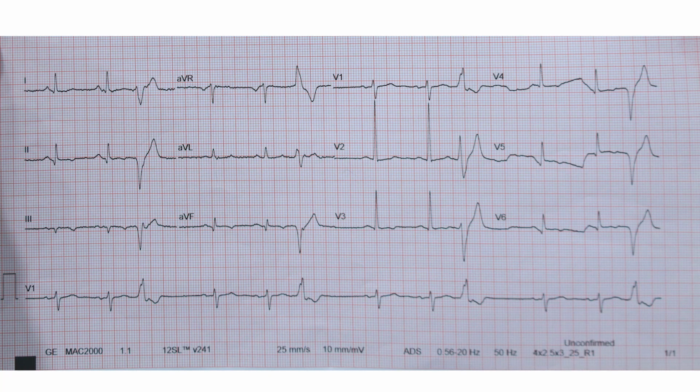We can appreciate on the 12-lead resting ECG a positive R wave in V1 and a superior axis and RS in aVL and odd axis. Actually, we can see also the transition.